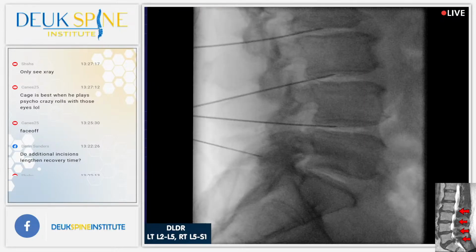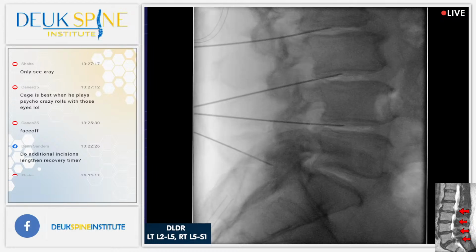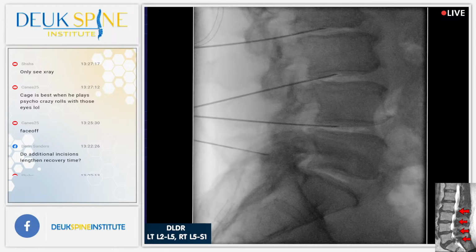Oh, man. Unbelievable. I think he has a Bertolotti syndrome on the right. A Bertolotti's. That's incredible. Basically an abnormal transverse process. That is huge. Oh, maybe I got past. You're okay. Okay, we're just working on the last one. You're doing great. We're almost done. Stay still. Shot? We're almost done here.